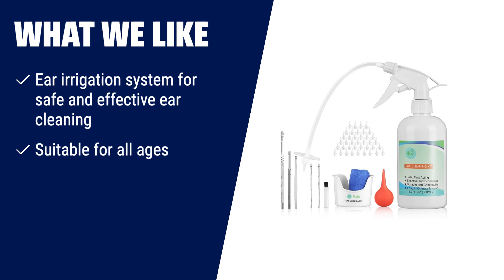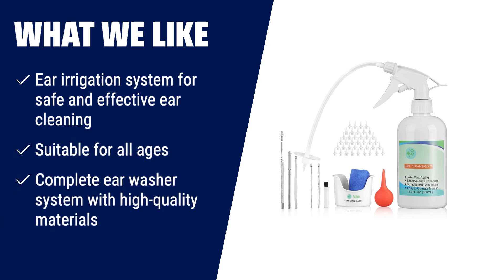What we like: Why spend time and money on clinic visits for ear cleaning when you can do it at home? The earwax removal tool provides a quick and easy solution for removing earwax. Its irrigation system safely washes your ears without damaging the skin. Suitable for all ages, it comes with a complete ear washer system including extra tips and a towel. Take control of your ear hygiene with this reliable and convenient ear cleaner.